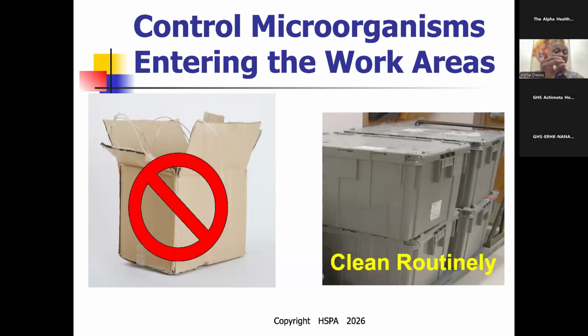I saw a lot of them in the ORs. These bring cockroaches, mice, bacteria. They call them shipping boxes. Shipping boxes. We don't need them. It's unacceptable.